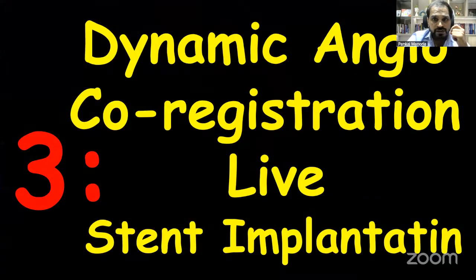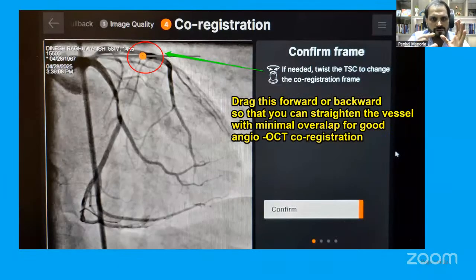The third important feature, a very important and very useful feature, is dynamic angio co-registration. With this feature, we can do live stent implantation looking at the OCT screen. We may not look at the angio screen. First, you have to do manual co-registration. For this, you have to drag this forward and backward. The crux of good angio co-registration is that the vessel should be straight. If it is rotated or turned away, then the co-registration may not be that accurate. For that, just scroll this orange mark forward and reverse so that the vessel is straightened.